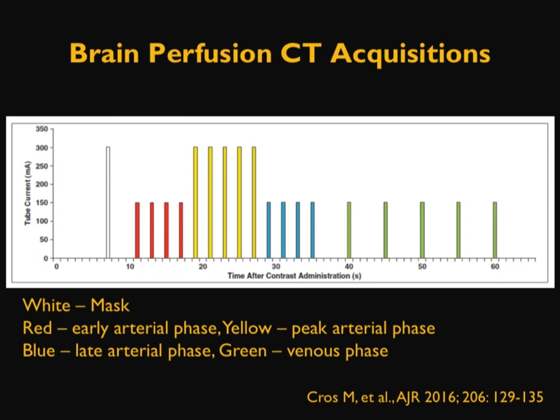So overall, CT perfusion can involve a lot of CT scans of the same volume, which raises a concern for skin radiation dosage. Skin exposed to the same dose beyond a certain level can develop skin erythema or hair loss, and that is possible in CT perfusion if the parameters and the way the scans are acquired are not optimized.